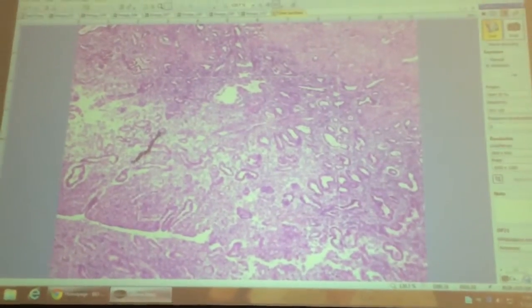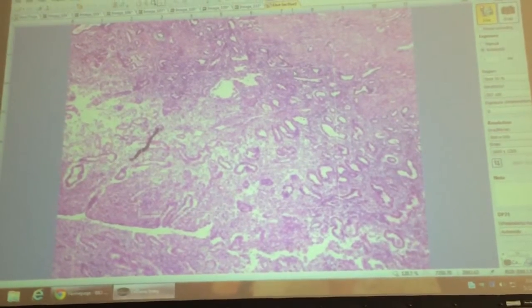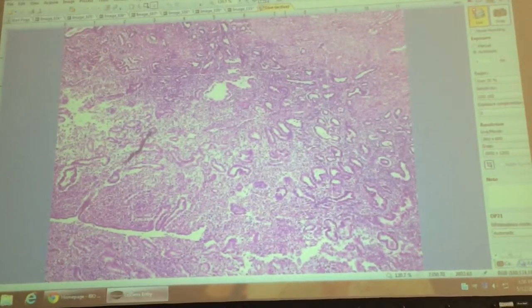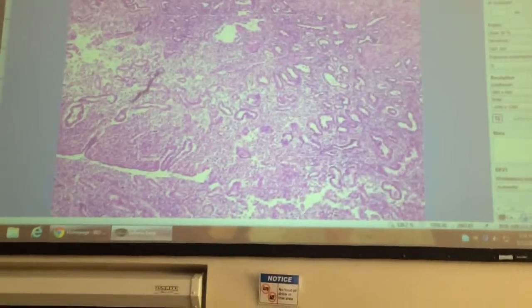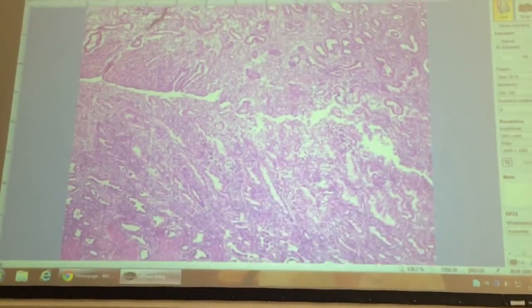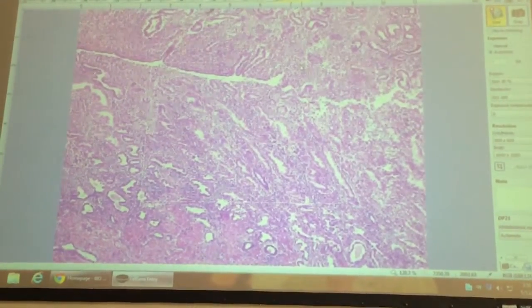This would be the lining of the uterus in here, so this would be like the lumen of the uterus, and this is the endometrium. Notice that what you're seeing is not a lot of cohesiveness to that endometrium. You can't follow these big long glands all the way through. They kind of look like they're just breaking down a little bit. They're not as structurally organized.